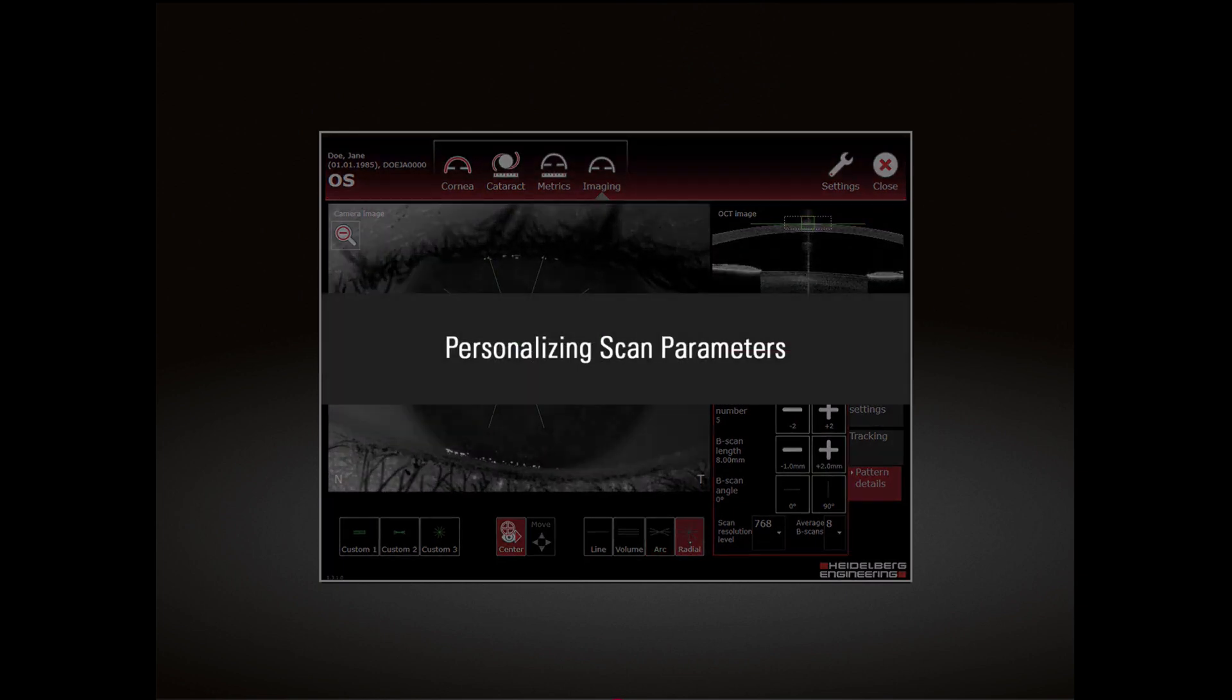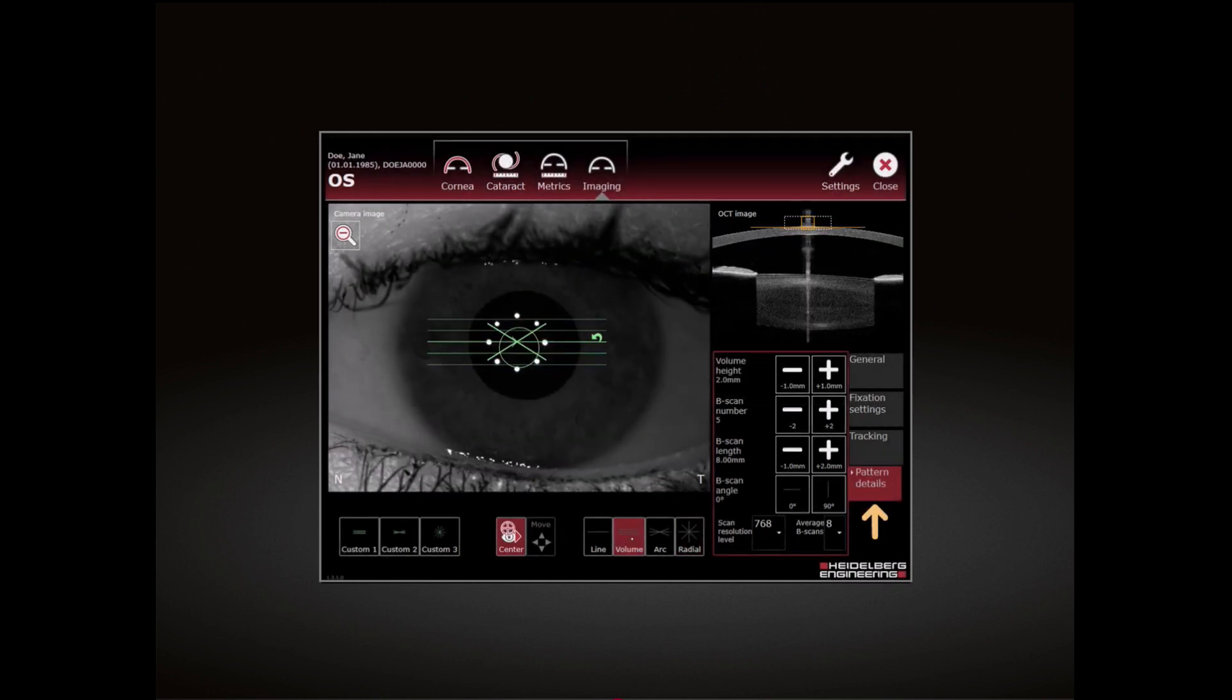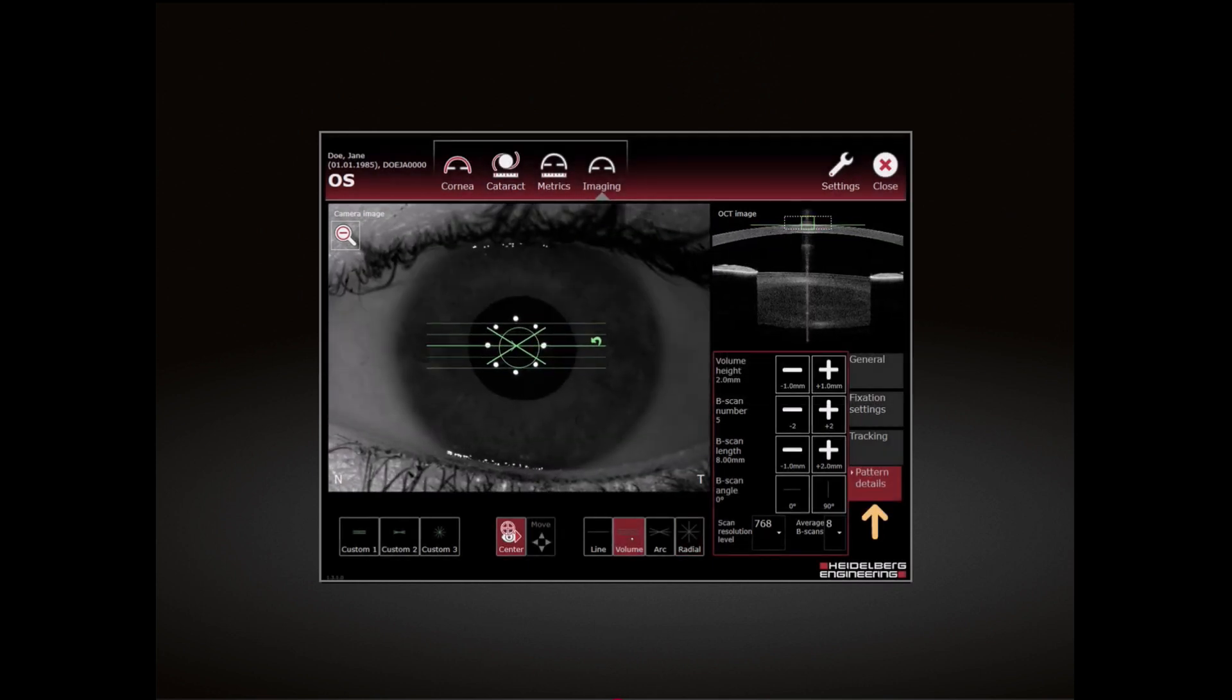Personalizing Scan Parameters: Select the Pattern Details tab to personalize the scan parameters.